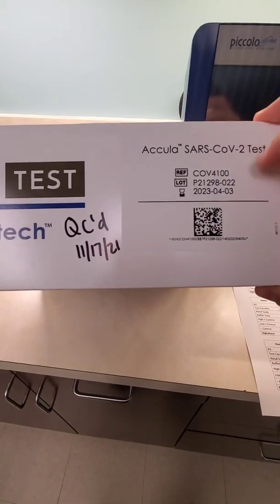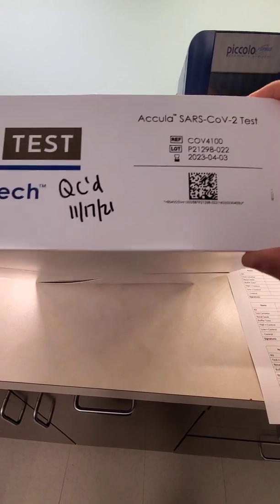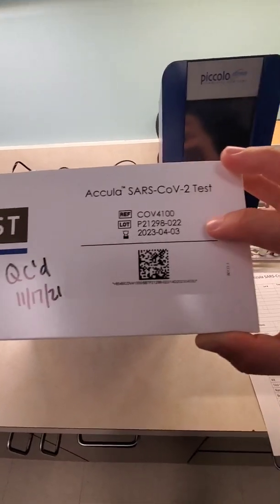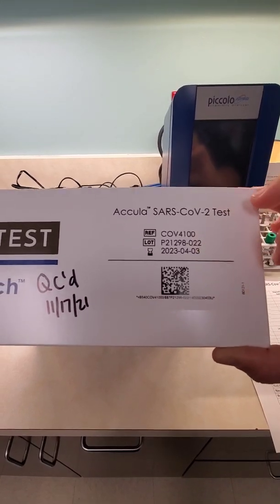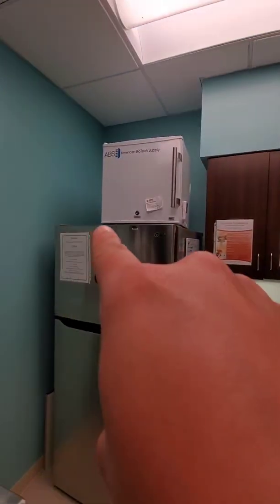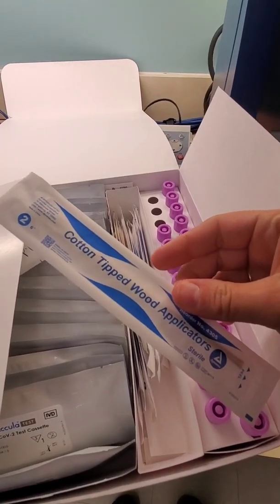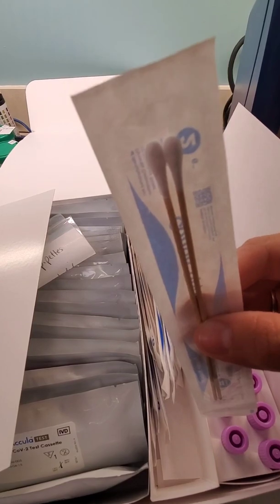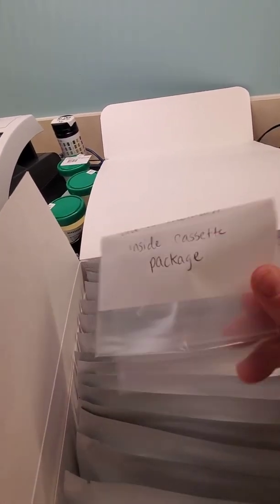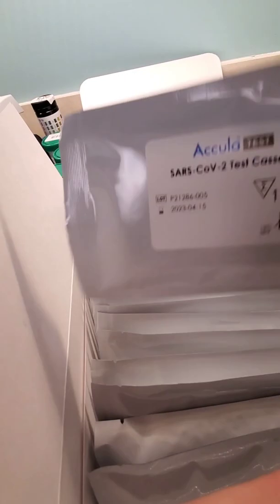This is the box it comes in. The QC material is in the box just like all of our other point-of-care tests. If the next box has the same lot number, you don't have to QC it — you QC that lot number once, it doesn't matter how many boxes it is. Technically if it's a different shipment, you're supposed to re-QC the box. The box contains buffers, and the swabs we use are just regular cotton-tipped — not the strep swab, which is rayon-tipped. It comes with a couple extra pipettes, and each cassette package also has a pipette inside, so just use them as you go.